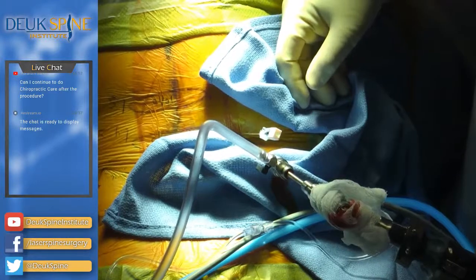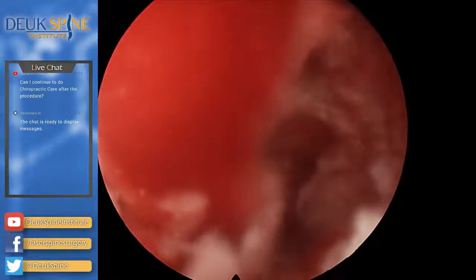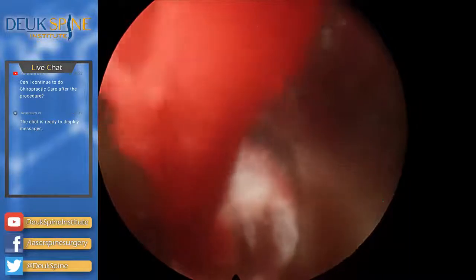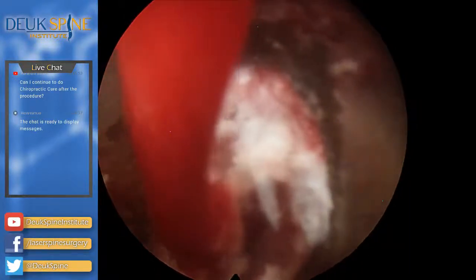One second, no. The fiber is outside. You see the fiber? It's in my hands. The fiber? You mean the fiber or the fiber?